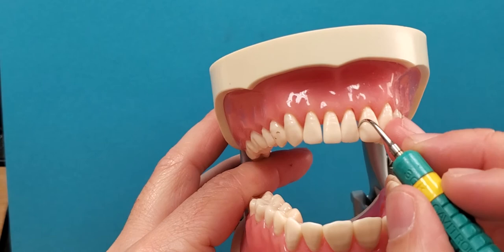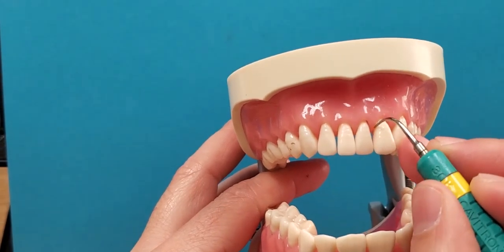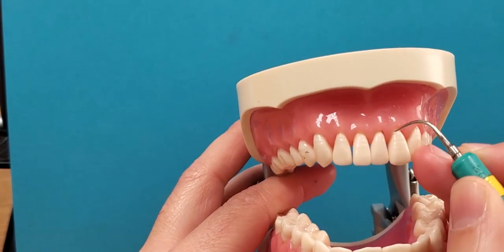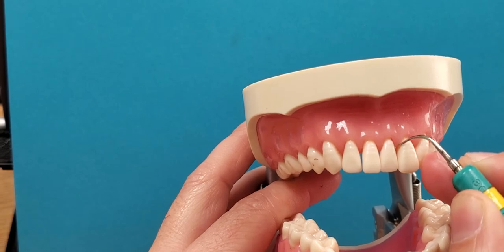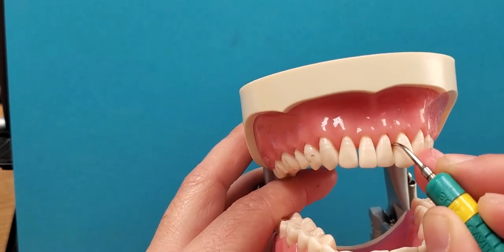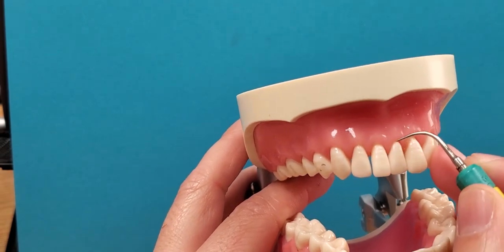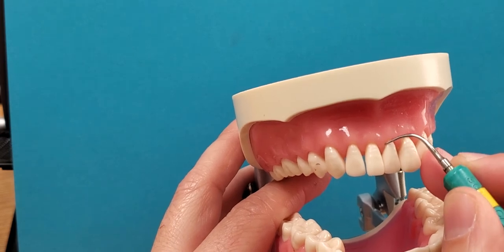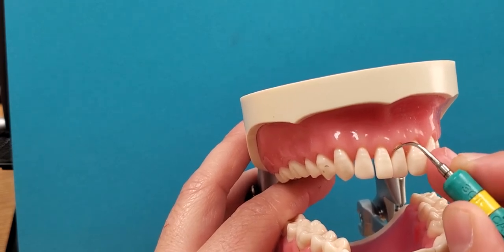So for the away surfaces you're going to go to 12 o'clock and again can only be used really interproximally. You can still come around the line angle.